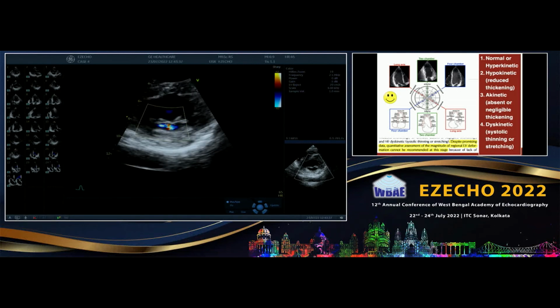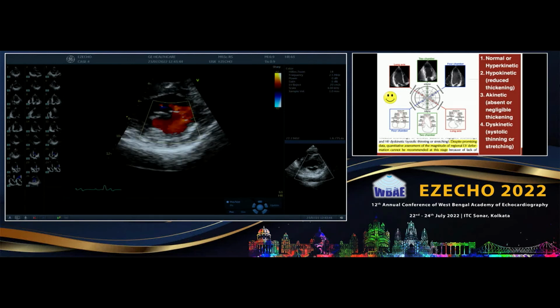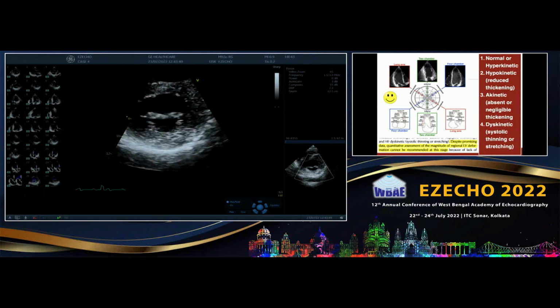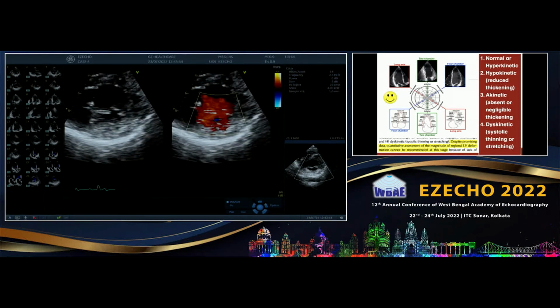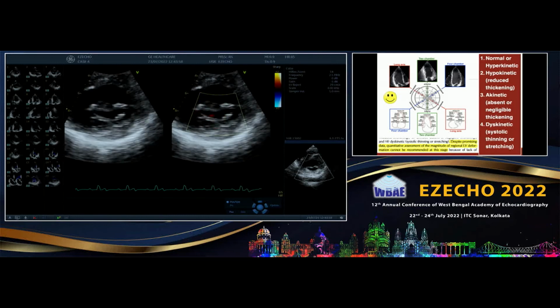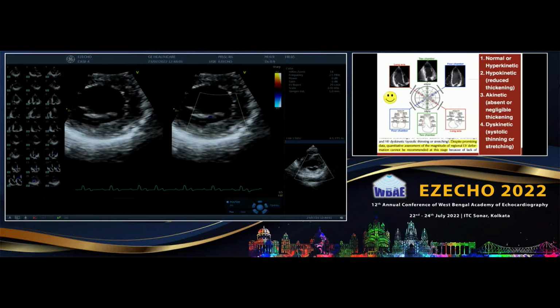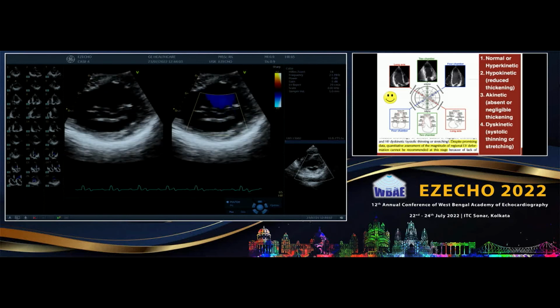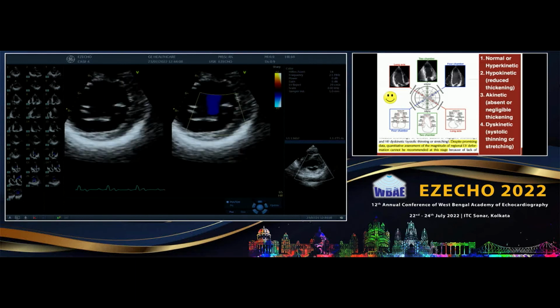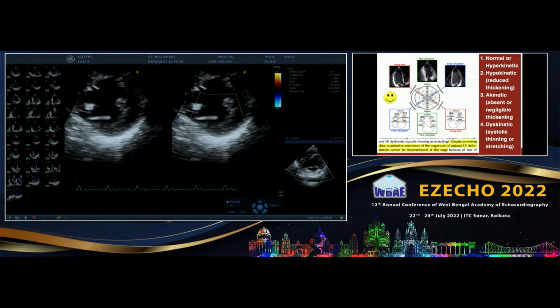For the simple reason, this commissure is being supplied by the inferomedial papillary muscle, which is distorting the cavity. You can even look at the papillary muscle also. Yeah, so you can see that this secondary MR is coming from this particular area. I had expected this just looking at the long axis, because I knew the mechanism of MR. So this is pulled because of the inferoposterior papillary muscle getting pulled. That is the mechanism. So always look for the mechanism of mitral regurgitation. This has got a tremendous therapeutic potential, as you know, in secondary MR in heart failure. Look at the papillary muscles.